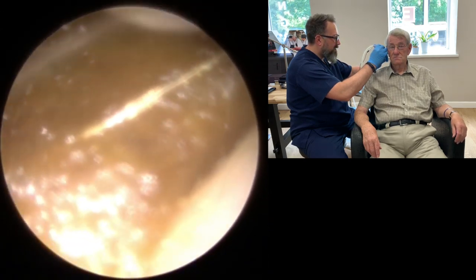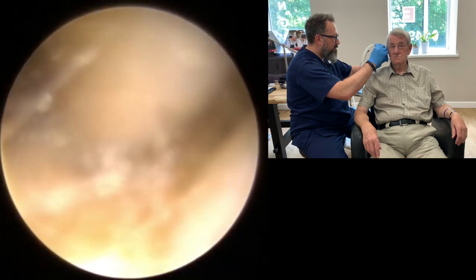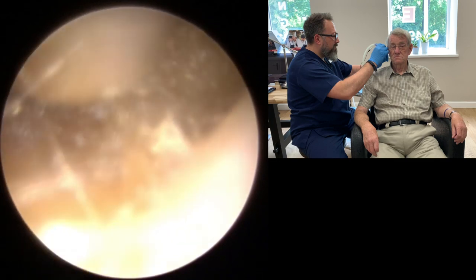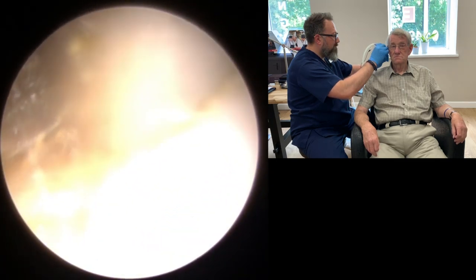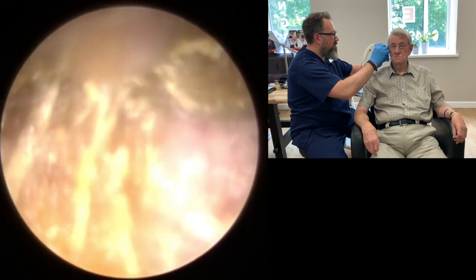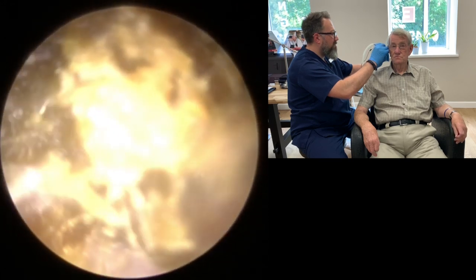So we're just going to clear the second ear for you now. So what we've got is very, very sticky wax at the entrance to the canal here. So we're just lifting that off the canal. There we are, just unsticking the edges.